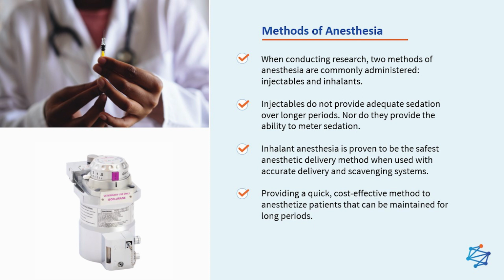The goal of both of these anesthesia methods is to sedate the patient. Injectables offer less control and do not provide adequate sedation over long periods, while lacking the ability to meter sedation. When properly used with accurate delivery and scavenging systems, inhalant anesthesia has proven to be the safest and most effective method to administer this life-saving drug, providing a quick, cost-effective method to anesthetize patients for long periods of time.